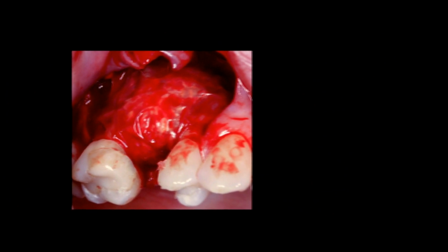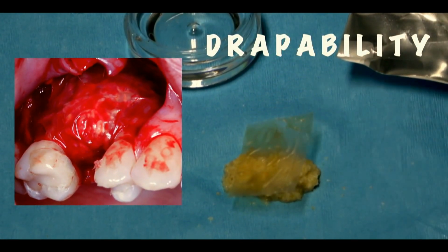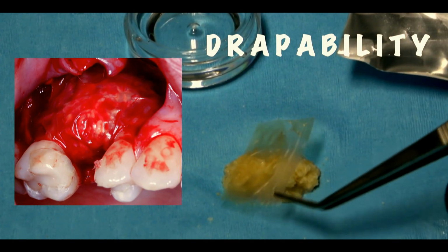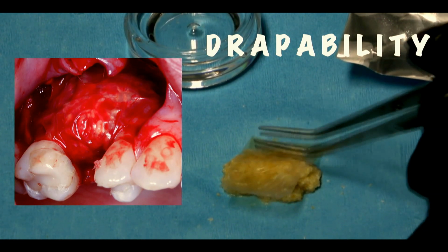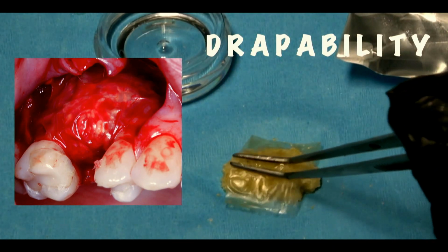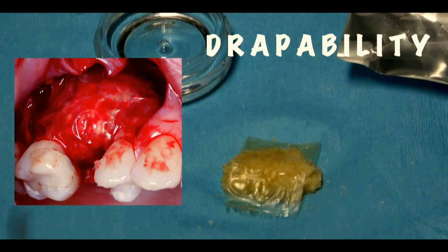And again, just showing the healing here, you'll see the ability of this material to drape. And this is the way we'll do this clinically: we'll place it with the dry instrument to the site, and you see it kind of has memory. It kind of wants to come back up. But the second you dip that second instrument in some saline and start to wet the edges of it, it will suck down, right? So it's important to have enough volume of bone, right?